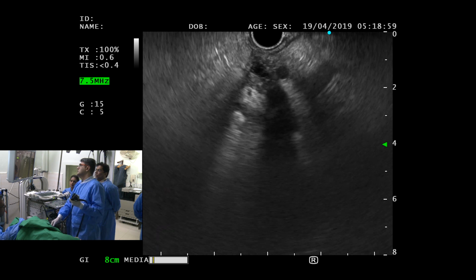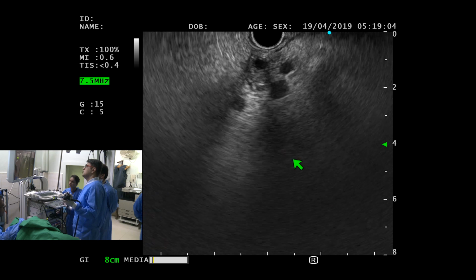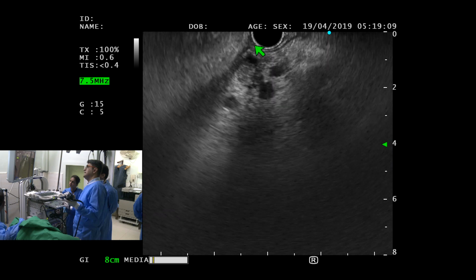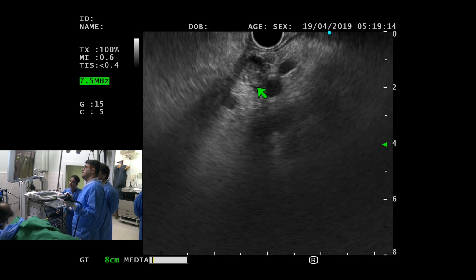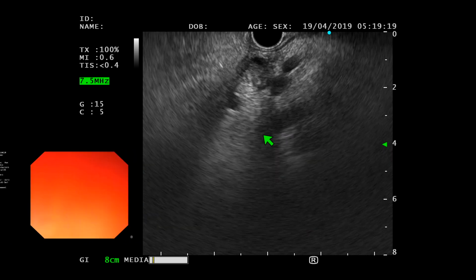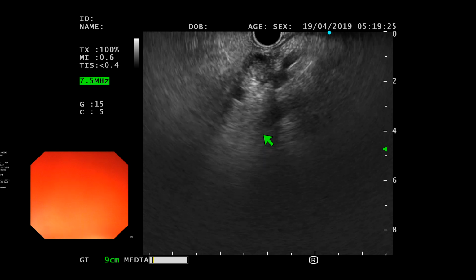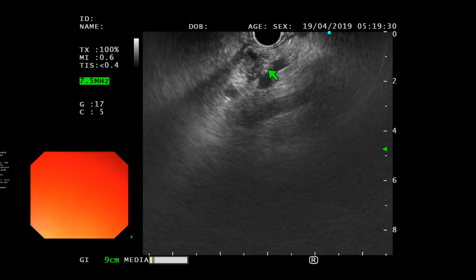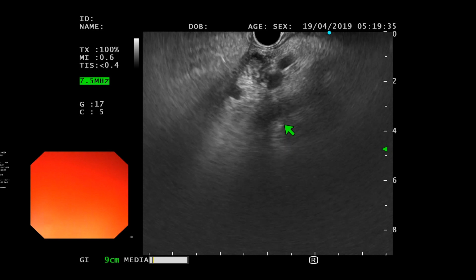Thank you. So, where's the cursor gone now? So far, we know this duct is dilated, we're in the body of it, and there is some periductal inflammation, and the pancreas, I have to say, rather looks atrophic. Yes. I'm at 4 centimeter. Let me just go to 5 and see what happens. Even if I go close, look at the splenic vein. It's just right next to my probe, so there's not much pancreas left.